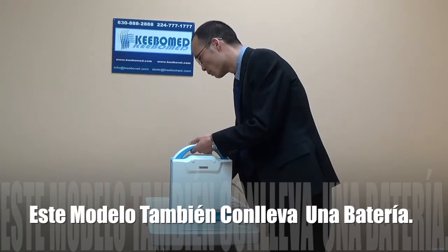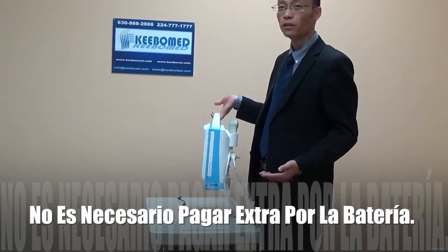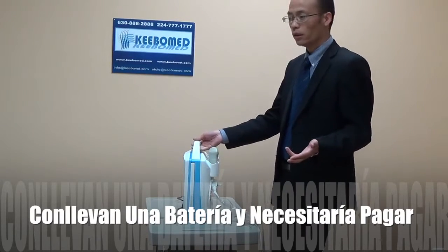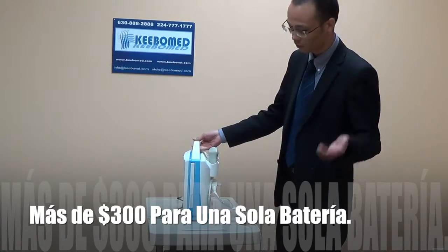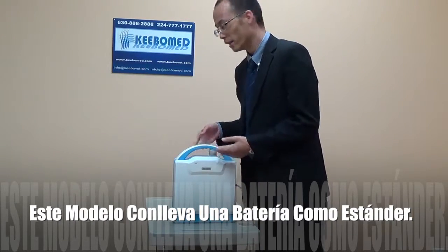This model also comes with a battery as standard configuration — you do not need to pay extra. For example, if you buy some other models like Echo 1 or Echo 3, you need to pay 300 US dollars extra for just one battery, which is not good for you. But this one has a battery as standard.